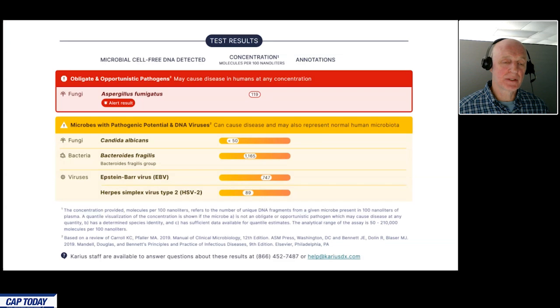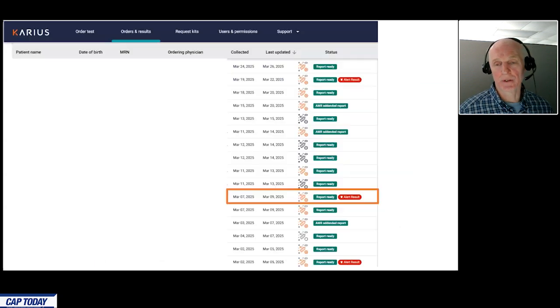The first patient, there are several results of viruses, Candida, kind of normal oral flora, and viruses you might expect to react in an immunocompromised patient. And you'd be right, this was an immunocompromised patient. This is a gentleman who had CLL, who had completed induction therapy and then was readmitted 3 weeks later. Febrile neutropenic, chest x-ray showed what appeared to be a necrotizing pneumonia, and certainly the detection of Aspergillus fumigatus, which did not grow in his sputum cultures, was impactful. He did respond to treatment with voriconazole.